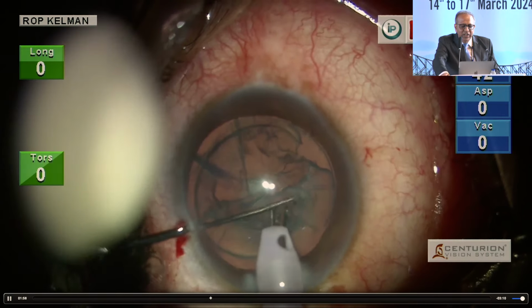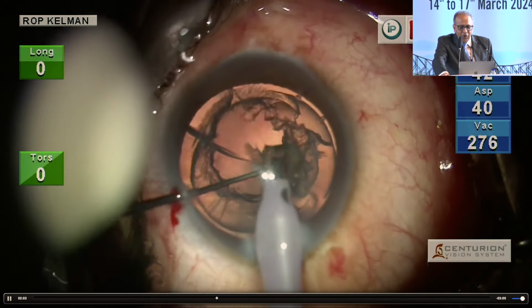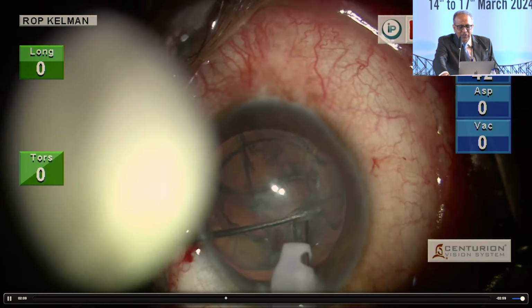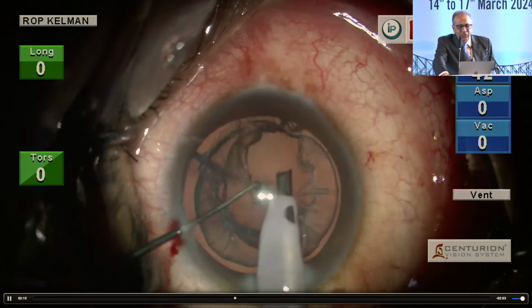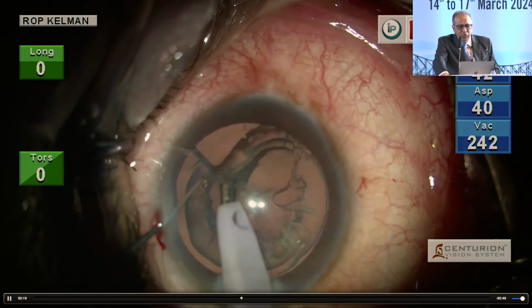Just see the CDE. The CDE is 0. At this point of time, I have taken out 2 layers. The third layer, I'm trying to take it out by just phacoaspiration. Lately, what I have started doing is this escape route, which Bob Osher always says you should use.